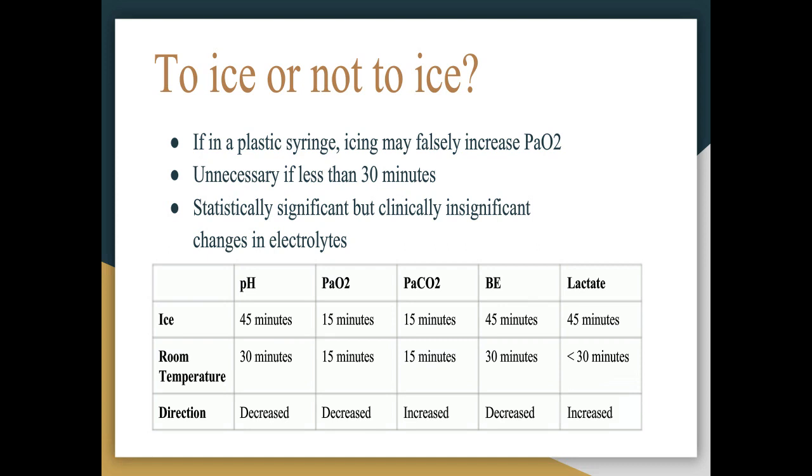As you can see, PaO2 and PaCO2 are equally affected within 15 minutes whether you ice or not. However, icing can prolong your evaluation of pH, base excess, and lactate. There are statistically significant but clinically insignificant changes in electrolytes that occur when there are delays in icing and evaluation.